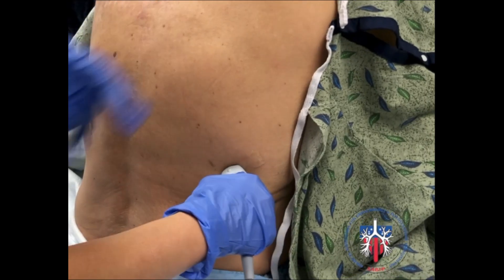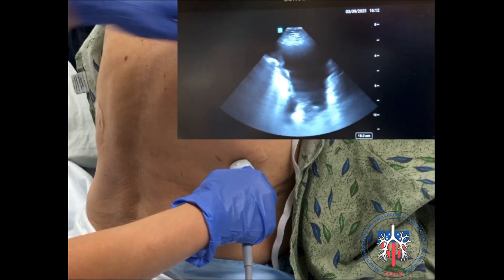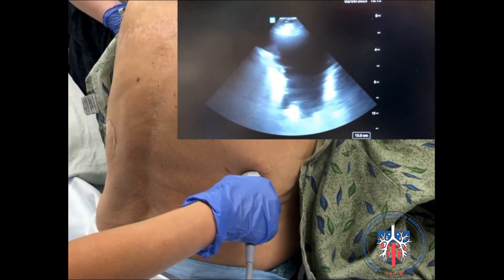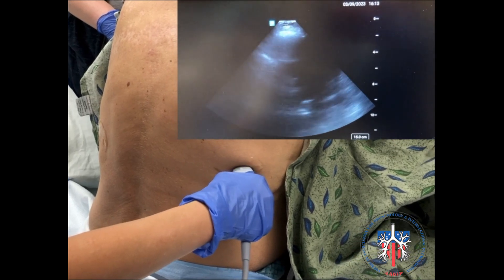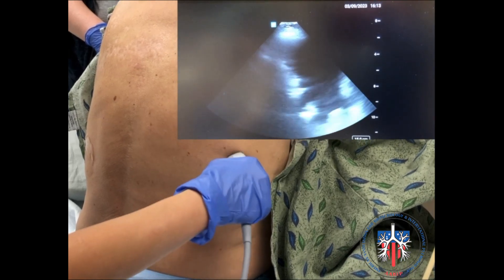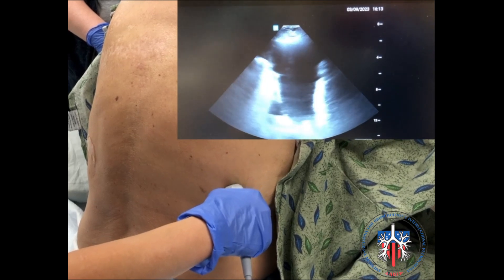To perform ultrasound, use the phased array ultrasound transducer with the abdomen exam type. Scan for the anechoic pleural fluid in relation to the hyperreflective diaphragm and the dynamic lung. Additional Doppler ultrasound to avoid vessel injury could also be utilized. Select the needle insertion point at the location of the fluid pocket, away from the moving lung and the diaphragm during respiratory cycles.